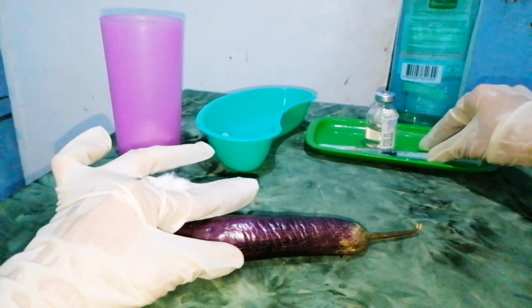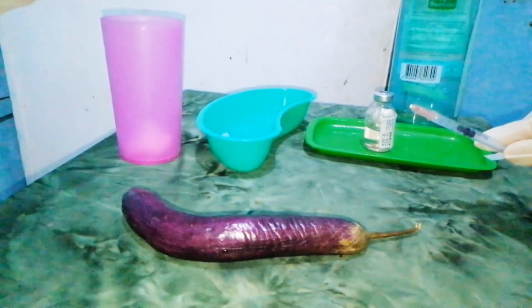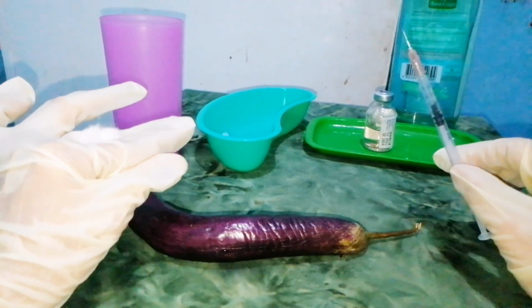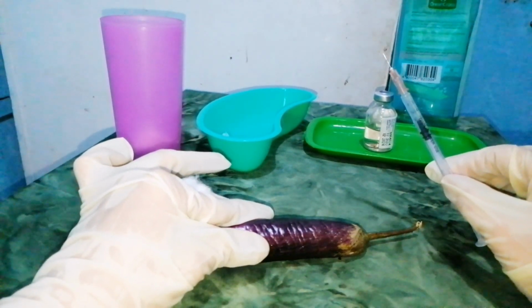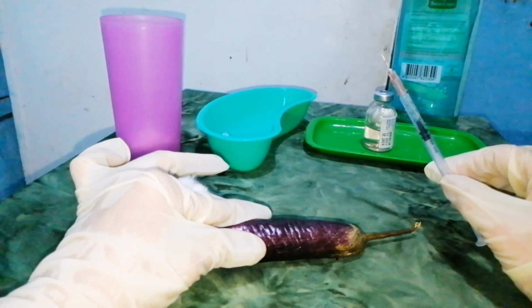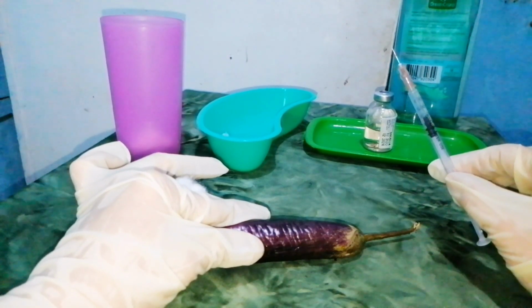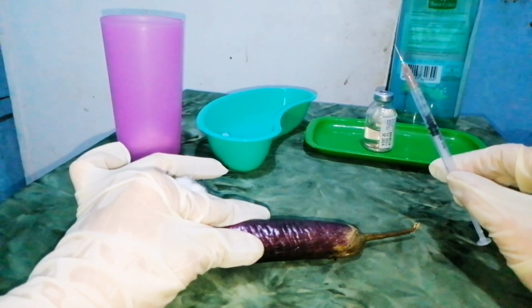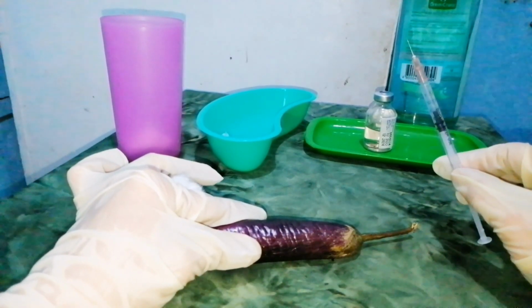And inject the medication. Discard the needle cap. Grasp the syringe in your dominant hand by holding it between your thumb and fingers, with the palm facing sideways or upward for a 45-degree angle insertion, or with the palm downward for a 90-degree angle insertion. Using the non-dominant hand, pinch or spread the skin at the site and insert the needle with a firm, steady push.